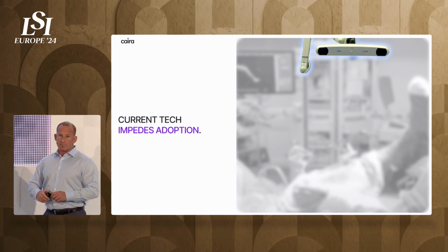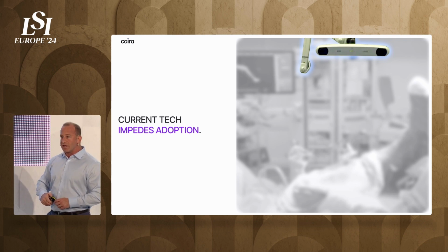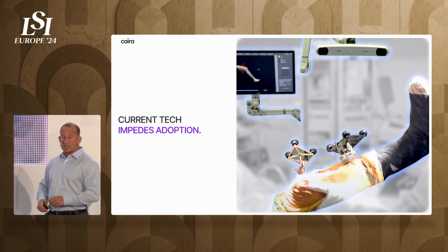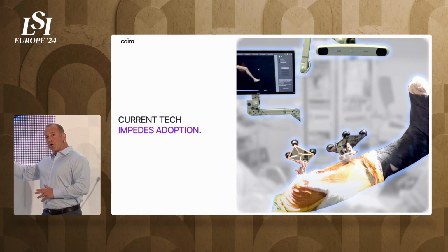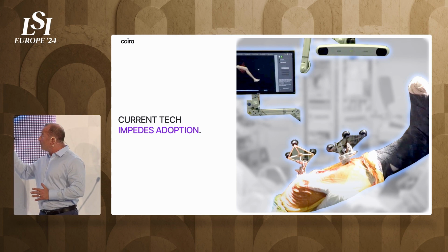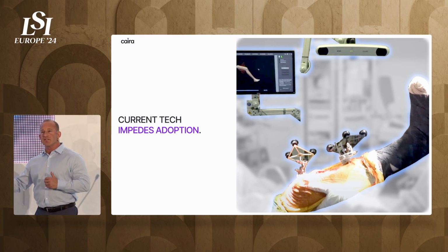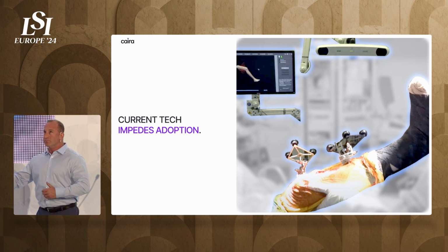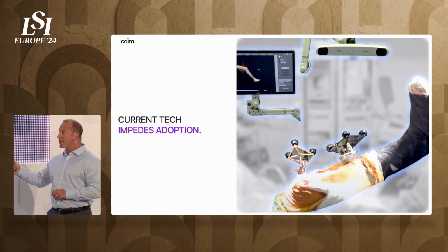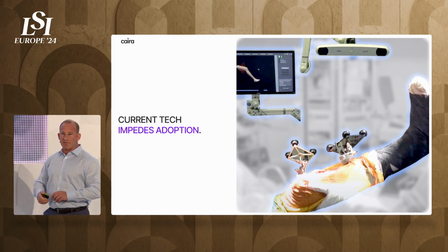Outside the field is a camera. That camera tracks the position of those fiducials, so it's in essence tracking the position of the anatomy as it moves through space. This camera is subject to line of sight occlusion, meaning if someone were to walk in front of it, or the assistant that typically stands across the table from the surgeon blocks that camera from seeing the fiducial, the assistant has to move. If you speak with orthopedic surgeons, that's probably their number one problem with optical tracking. Not only the fiducials and the pins and the invasiveness and the time it adds to the procedure, but also they have to ask their assistant to move out of their normal position.